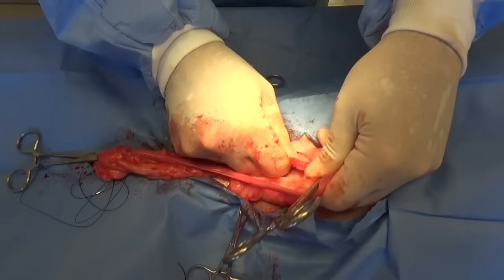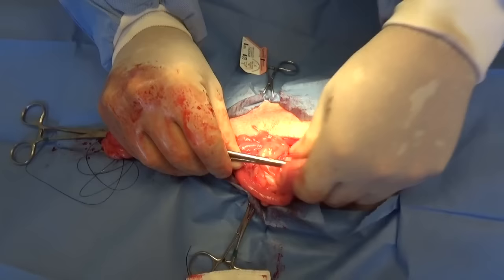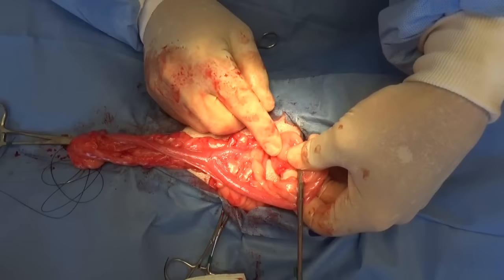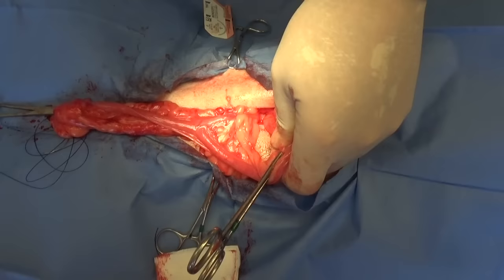These surgeries where they're big dogs and there's a lot of fat, it's not a simple surgery. I can feel the ovary right in there. And I'll show you on the other one. But you can kind of see, well, you can't see it, but the ovary is right there. See that little, see there's fat, and then see that little bean? Right there, there's the ovary. So if I tie down here below it, I know I'm below the ovary.